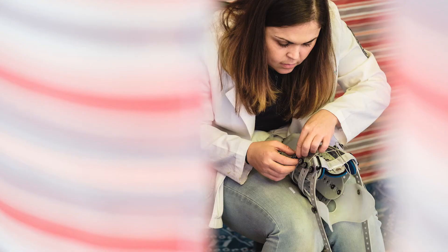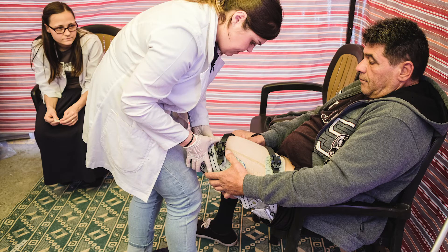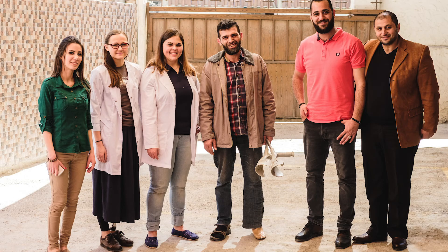I was invited by an organization in Latvia to come with them on a trip to Jordan, and my role would be fitting prosthetics. I had never been there, and they had never taken a trip of this type. We went with really no expectations, didn't know what equipment we would have. But I took two socketless sockets based on some measurements I got prior, and had great results. We were able to make all adjustments on site without having to pull new plastic or make new plaster.